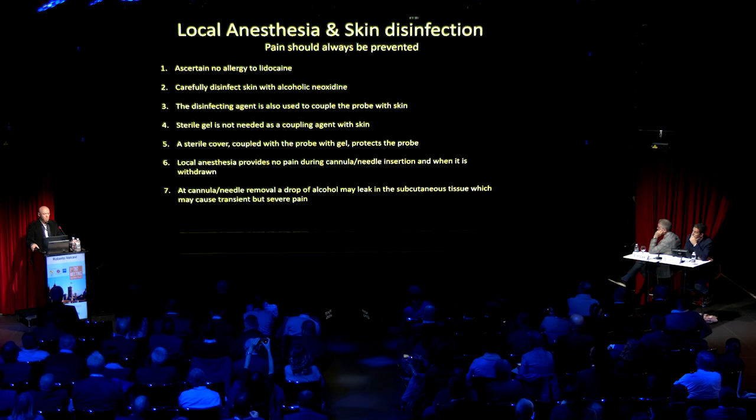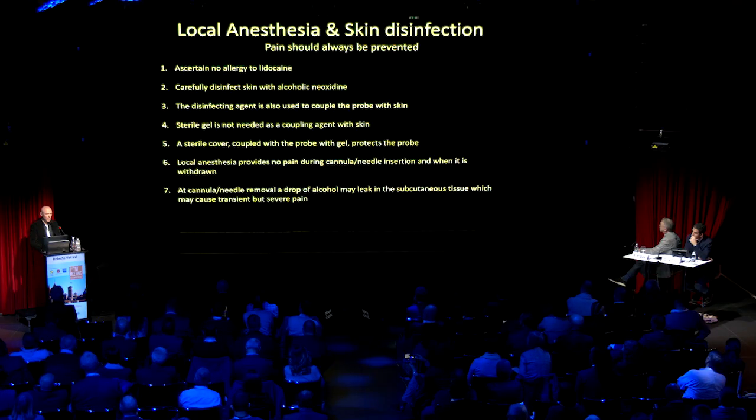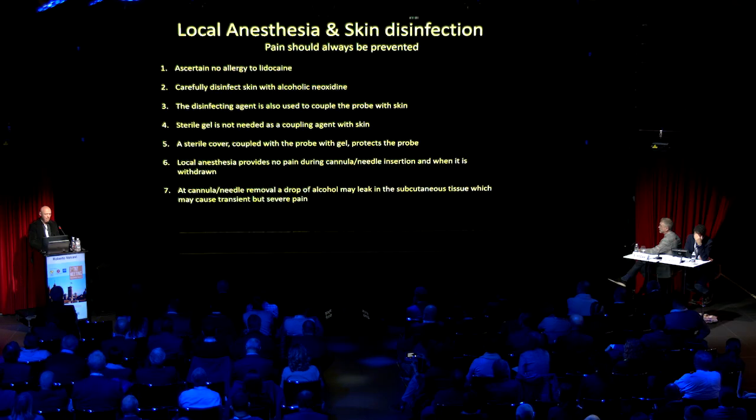And it's a tip that I give to you. The disinfecting agent is used to couple the probe with skin. So you don't need sterile gel as a coupling agent, which makes a mess. A sterile cover coupled with the probe with gel protects the probe.